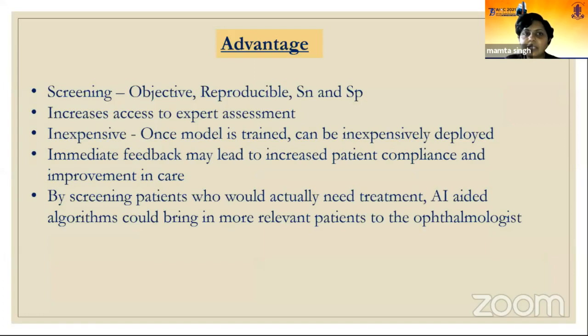Definitely, it helps us in screening disorders. It gives us objective, reproducible results with good sensitivity and specificity. It increases access to expert assessment. Once it is developed, it can be run on any computer, so definitely it becomes inexpensive in that case. It can give us immediate feedback, which can increase patient compliance and improve final patient care. And by screening patients who actually need treatment, we can bring more relevant patients to the ophthalmologist. That is one of the major advantages.